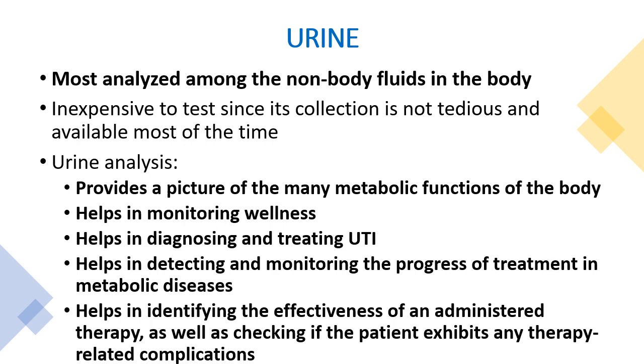Na pinaka-common na nare-receive natin sa laboratory, we have the urine. It is the most analyzed among the non-blood fluids in the body. So urine analysis provides a picture of many metabolic functions of the body. It helps monitor wellness, helps in diagnosing and treating UTI, helps in detecting and monitoring the progress of treatment in metabolic diseases, and it helps in identifying the effectiveness of an administered therapy.